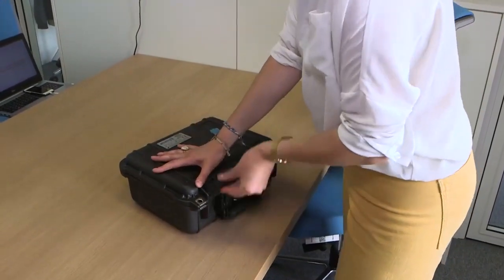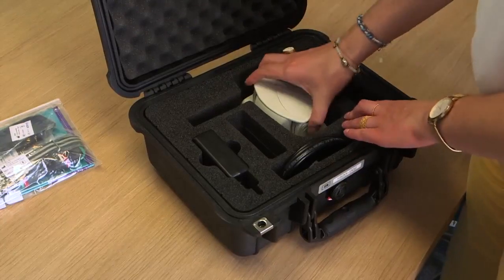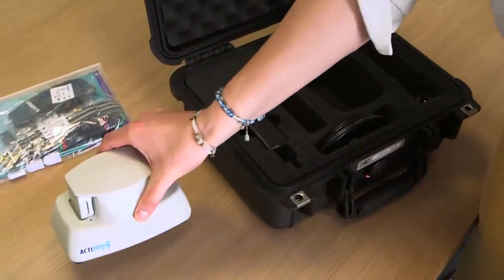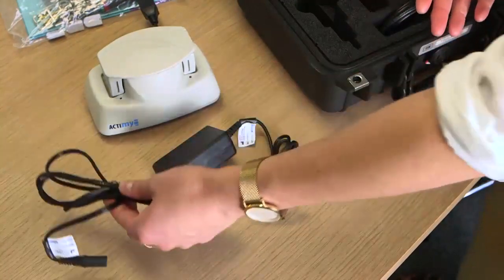To prepare for a participant's visit to the clinical center, first check the suitcase contents. The suitcase should contain the docking station to plug in the sensors during the night for data uploading onto a USB key and the battery recharging, and the power cord divided into two pieces to connect the docking station to a power supply.